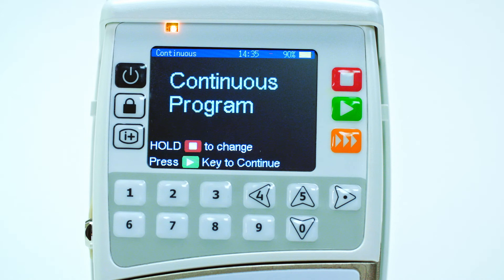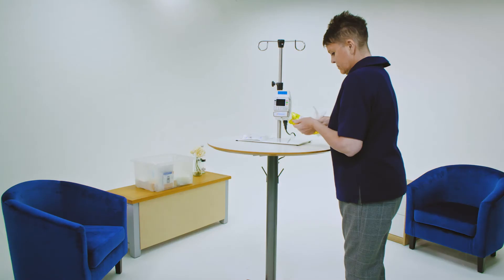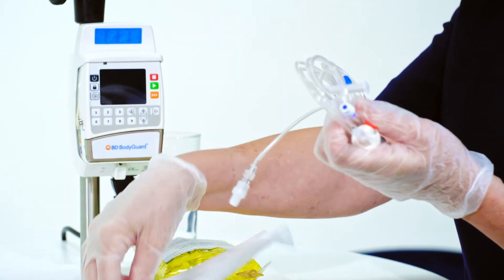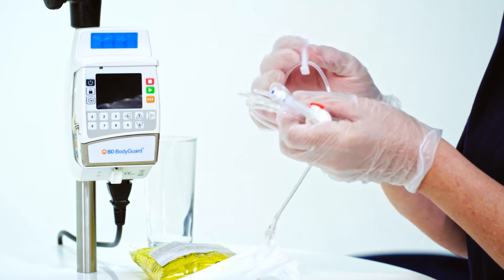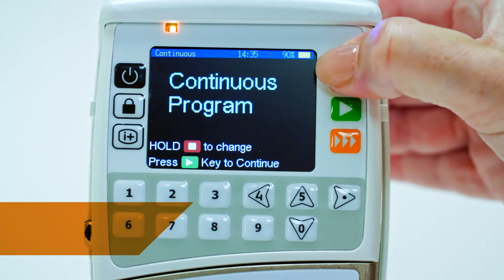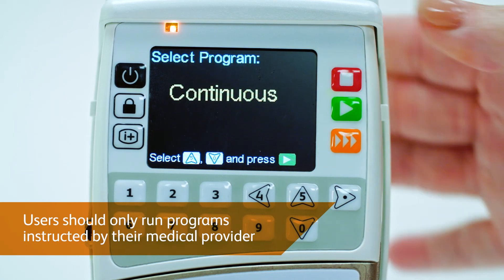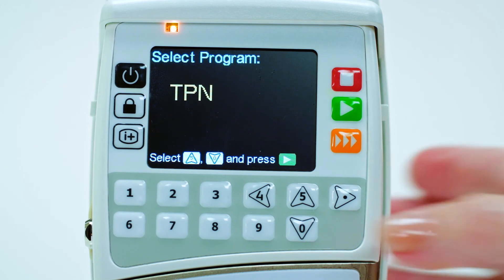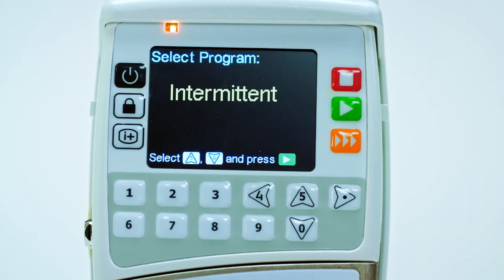For more information, refer to the directions of use guide. The BD Bodyguard infusion pump has a variety of program settings for administration of various treatments. You may only ever need to use one or two of these programs. Users should only run the programs instructed by their medical provider, who will share further guidance on the setup required for your treatment plan.